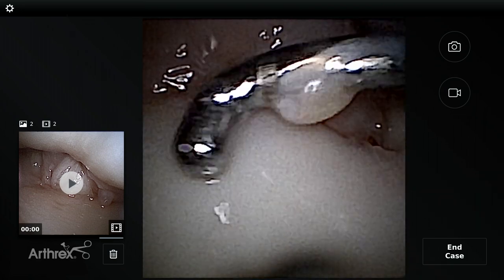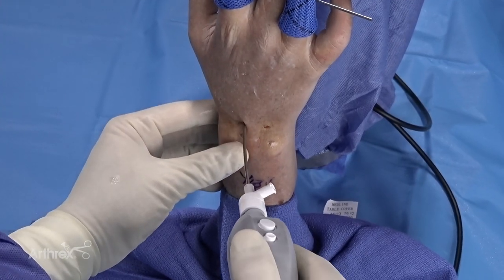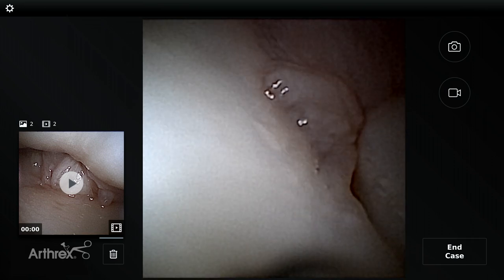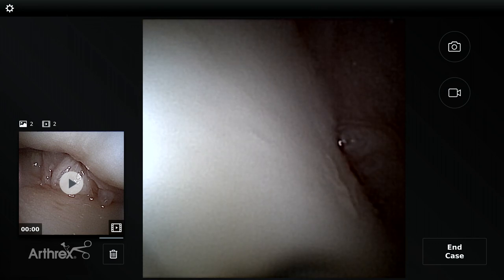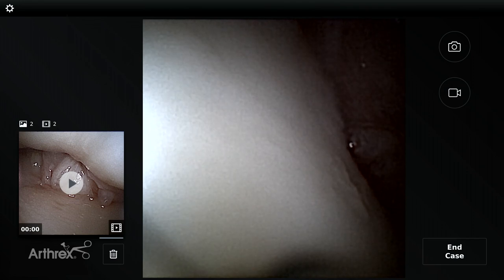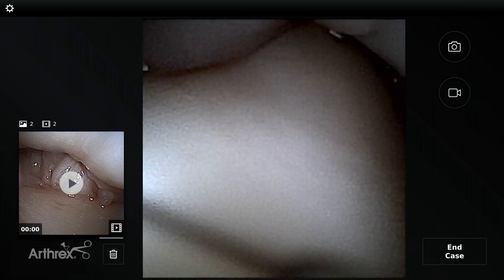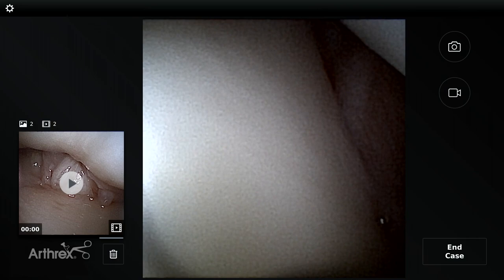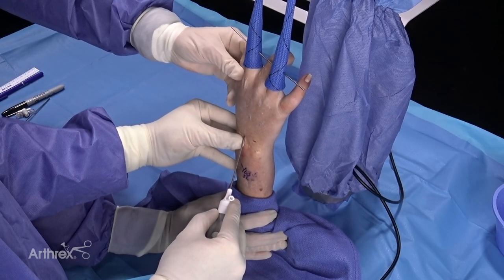I'm stressing the dorsal side and you can see this is pretty stable. What I particularly like about this field of view: here's the scaphoid, and there's the lunate next to it. So when we have a scaphoid fracture — unless it's a proximal pole — this is where we're going to see it. For arthroscopic scaphoid fixations or arthroscopic scaphoid non-unions, we're getting an unparalleled view along the length of the scaphoid. We can simply drop our hand and follow the distal pole of the scaphoid into the STT joint.